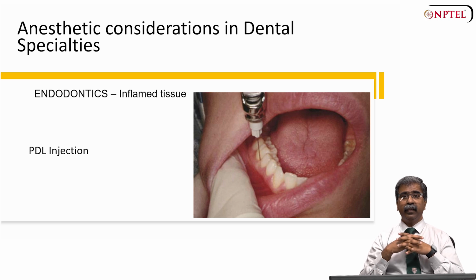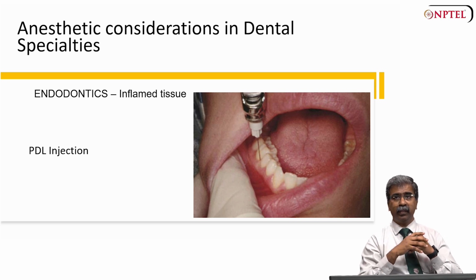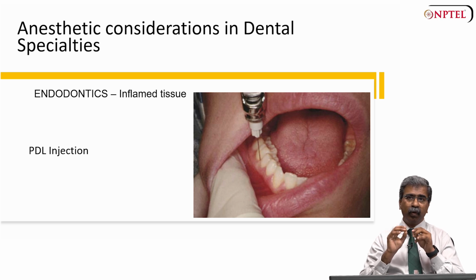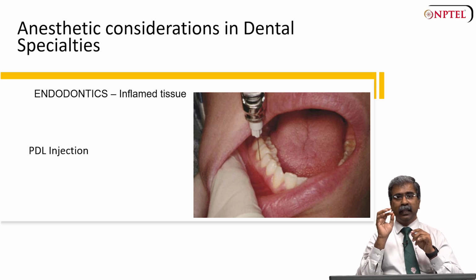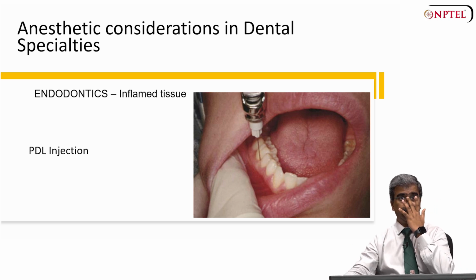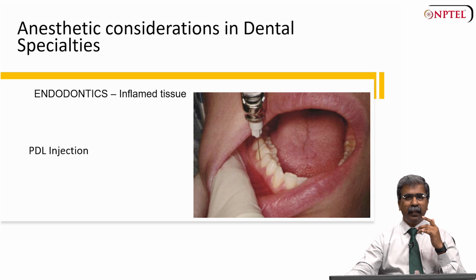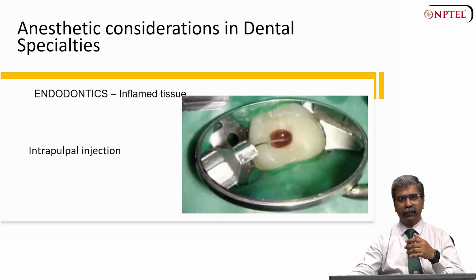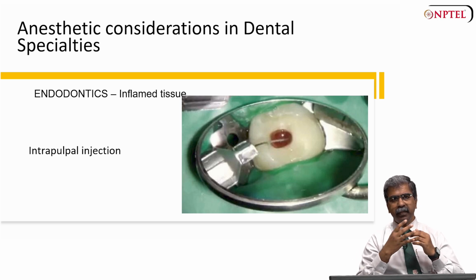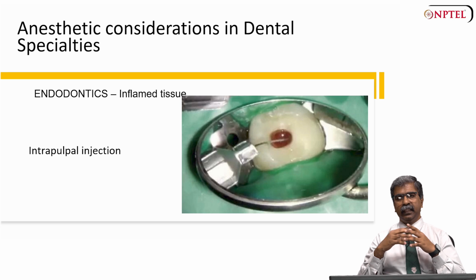Periodontal ligament: again you can use a 27 gauge short needle, and insertion is between the interproximal bone and the tooth to be anesthetized. Always remember the bevel should be facing the tooth, and 0.2 cc of local anesthetic is sufficient. Intrapulpal, as I mentioned earlier, is for inflamed tissue.